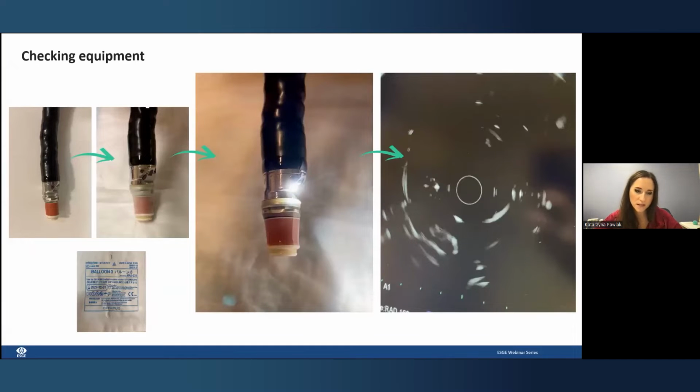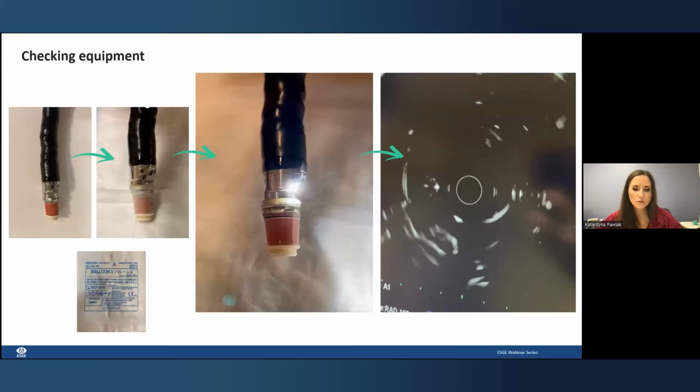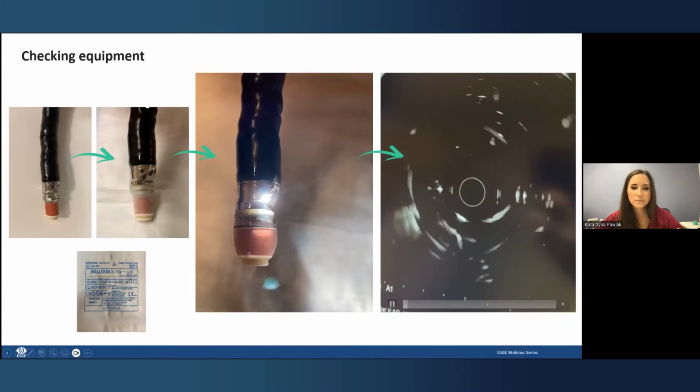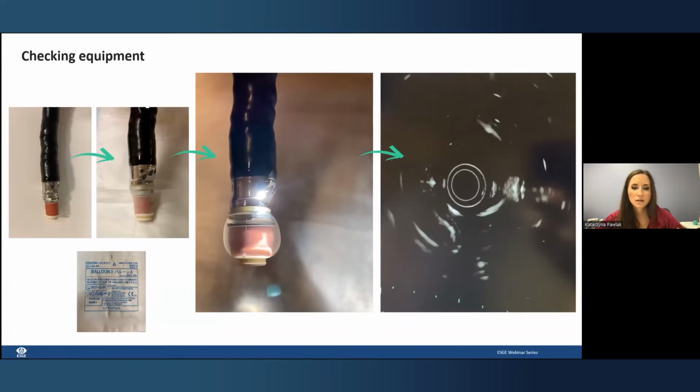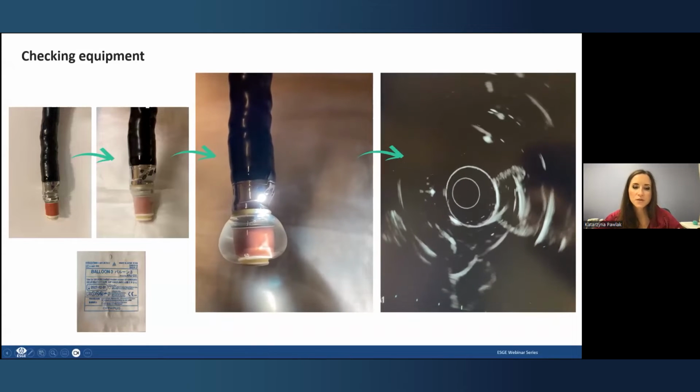I will come back to the slide to show you. And aside from that, I can ask David to show again the previous one. Yeah. So we are inflating the water, then we are desufflating, so we can see how it works.